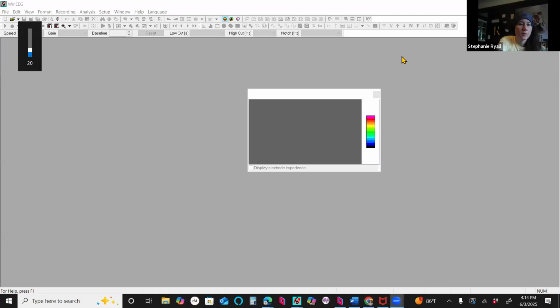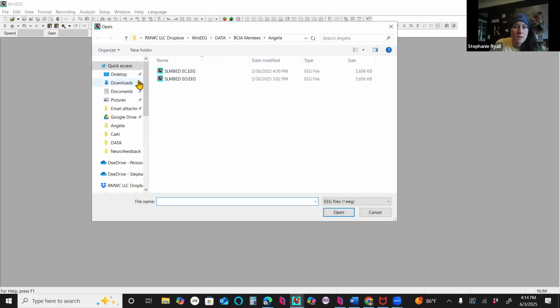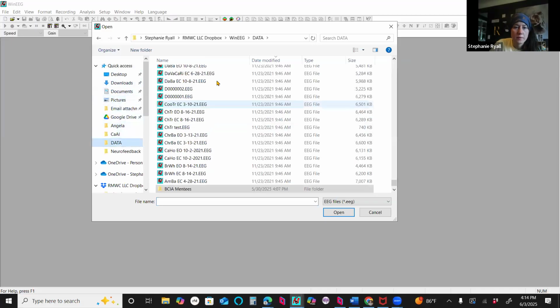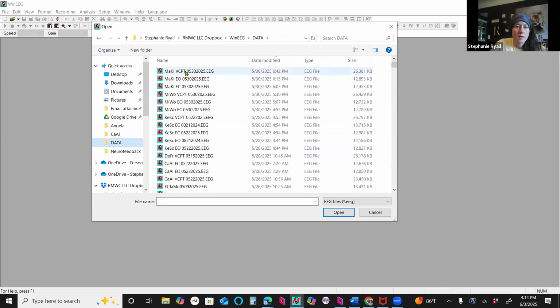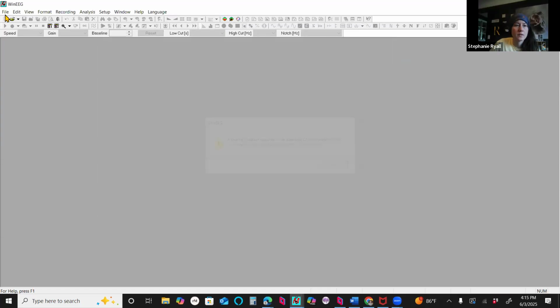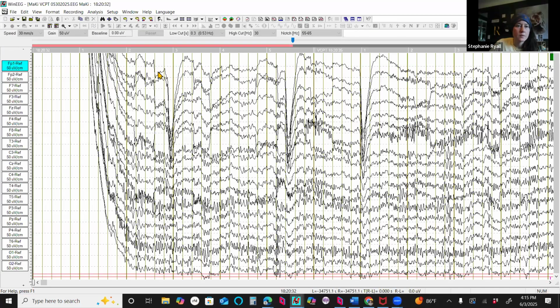Okay, here we're going to run through how to prepare a VCPT file for processing. So I'm going to go to my folder with recordings and select one here. If you ever double click, that's just my Dropbox from my other computer. If you ever double click and it doesn't seem to work right away, don't click again. WinEEG just sometimes takes a little bit to load it.